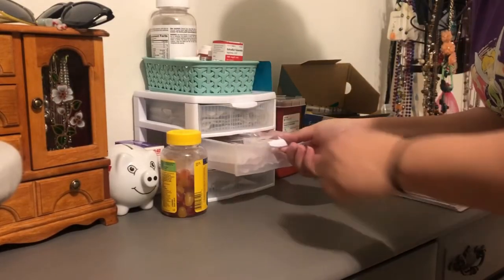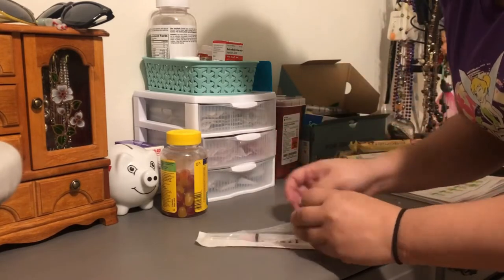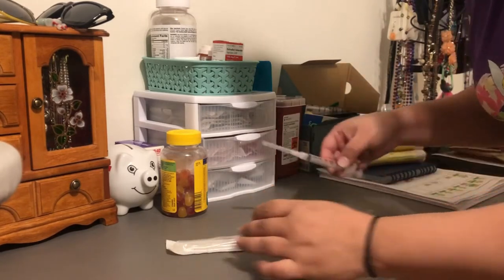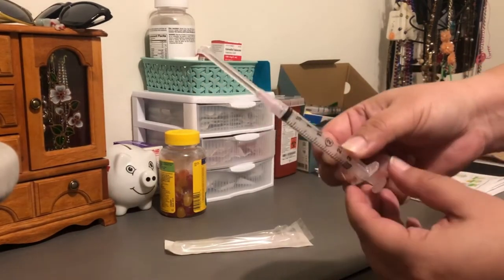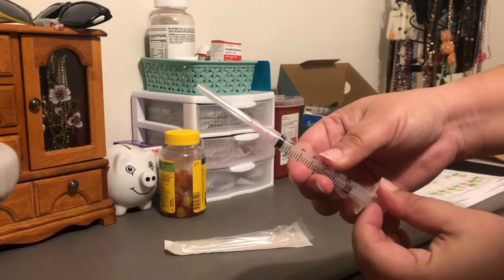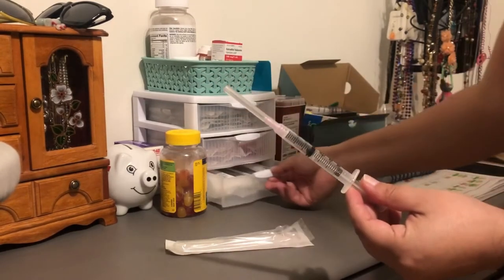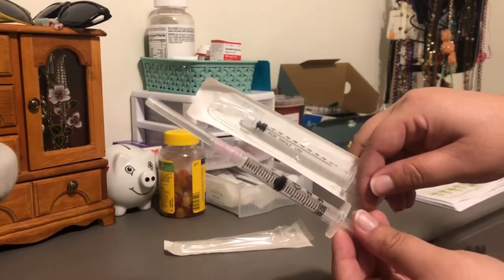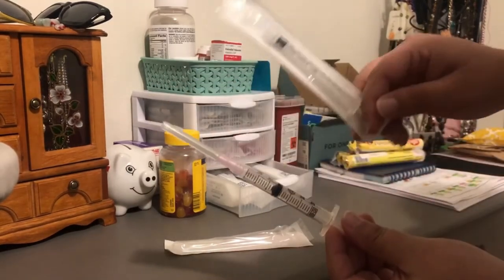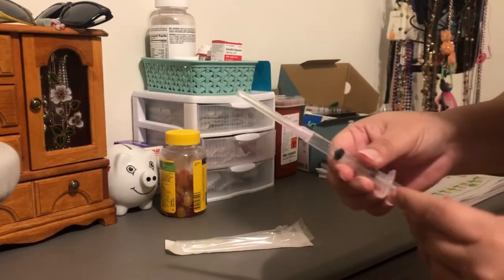First I'm going to get my drawing needle. This one is a little bit different because the needle is actually already attached and it's a much thicker syringe than the other ones. You can see the difference in the syringe between the one I need to do today and the ones I've been doing — this one already has the needle attached.